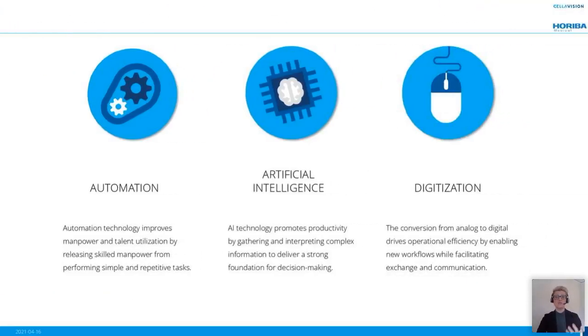our concept. And I just want to track back again to what we talked about in the beginning. What is a digital cell morphology system? We have the automation, that is the hardware, the systems that make it a bit faster. We have the artificial intelligence that is trained to recognize cells. And of course, then the digitalization, moving towards screens and software and applications.